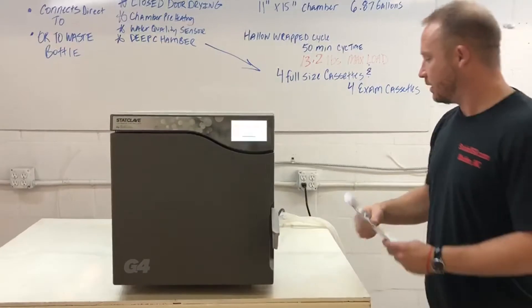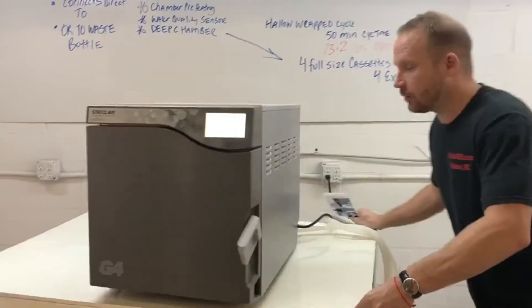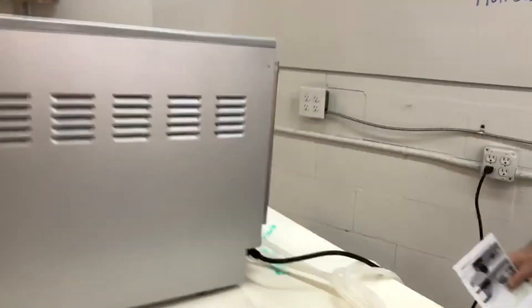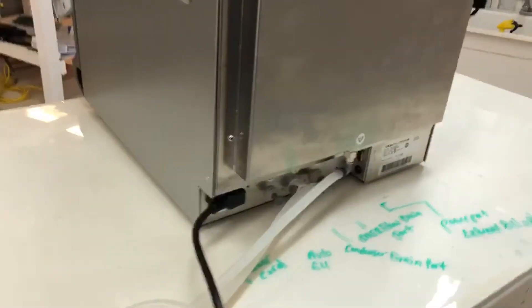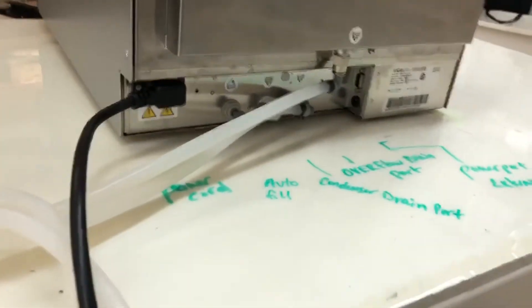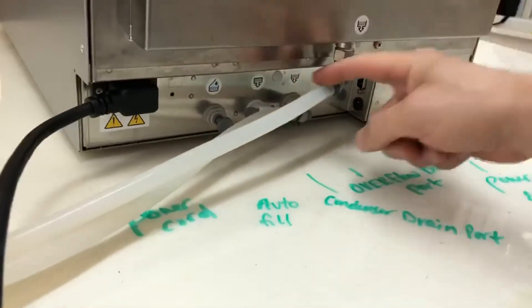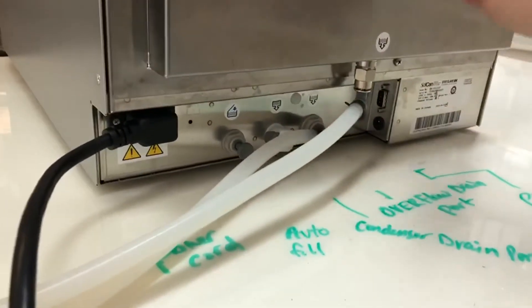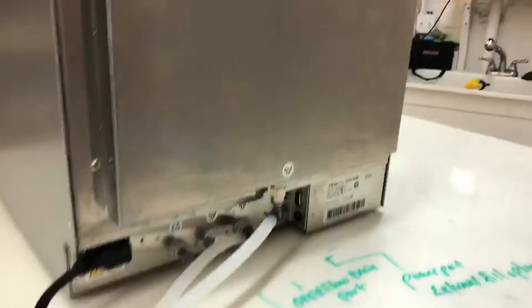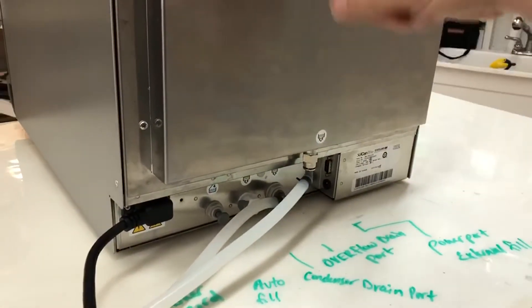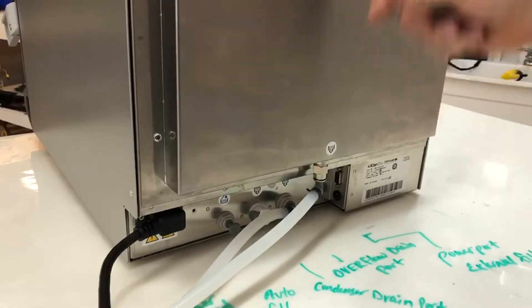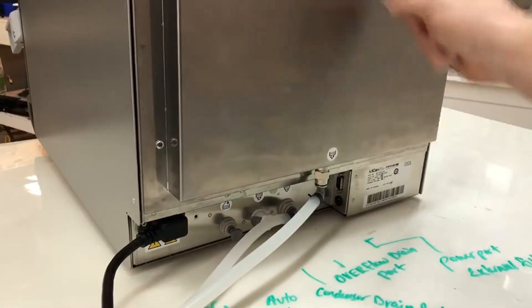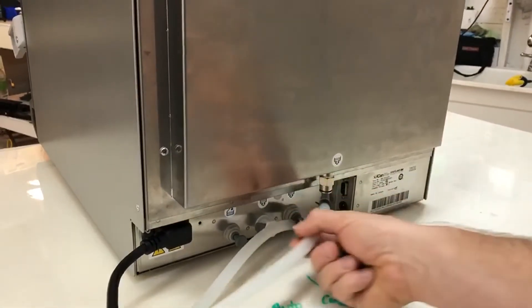Then we're gonna come to the back. You'll see there's multiple fittings. This is for the condenser waste bottle. Actually the condenser is inside of this instead of the extended waste bottle, which is like on the statum 2000, statum 5000. The coils are in here. So this is the condenser waste bottle out.